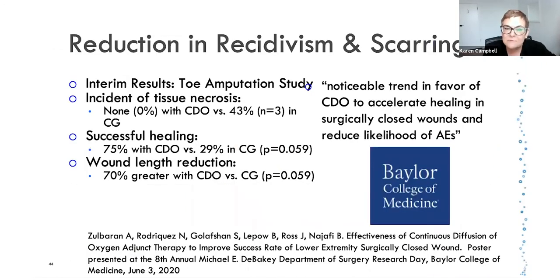The other interesting research that has been done recently in the US, and this is a pilot study, and these are interim results. And this was done by a surgical group out of Baylor College of Medicine. They were having a lot of problems with toe amputations, and they were having a lot of these amputation sites dehisce and open up. And so wanted to do a study to see what the impact of CDO would be over a closed amputation site.